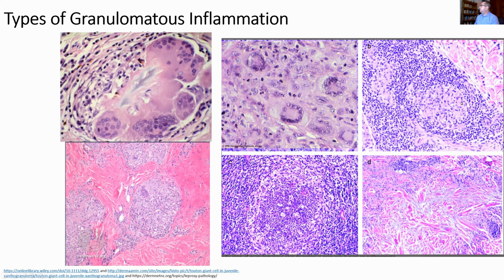And then here you can see a fairly well-formed granuloma with surrounding lymphocytes. So the lymphocytes are present a little bit in the granulomas, but not much. And this is the term naked granulomas that we associate with the sarcoidal pattern. Tuberculoid can be variable. You can have true necrosis in it, variable amounts of neutrophils, and often implies an infectious pattern. Here's suppurative. So suppurative and granulomatous, which I said is an infectious pattern.